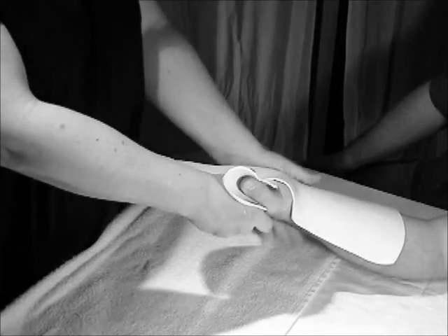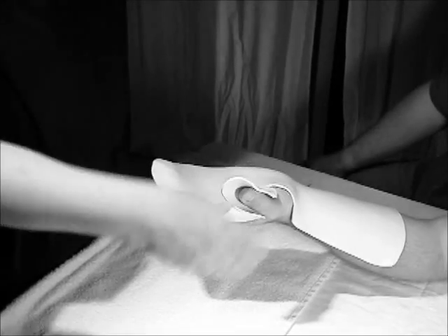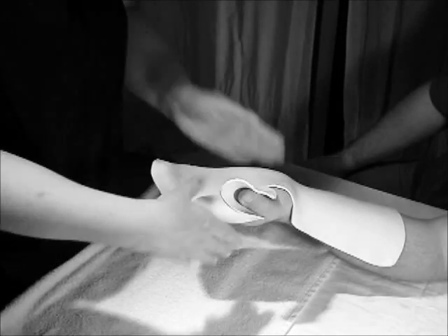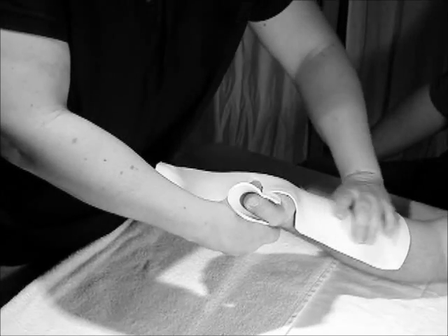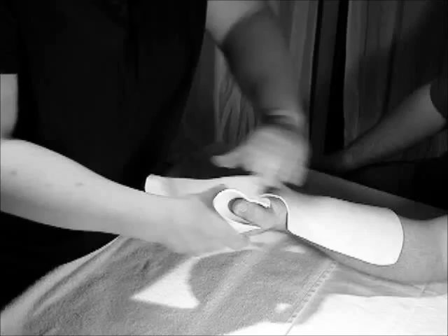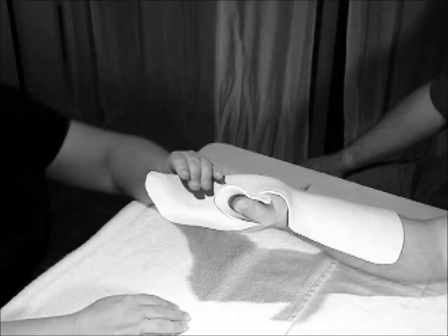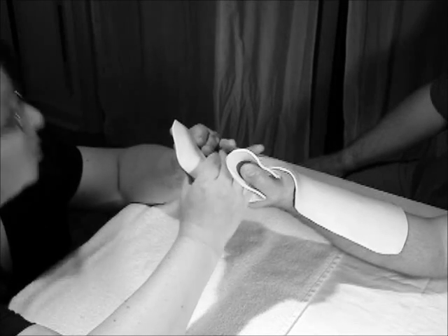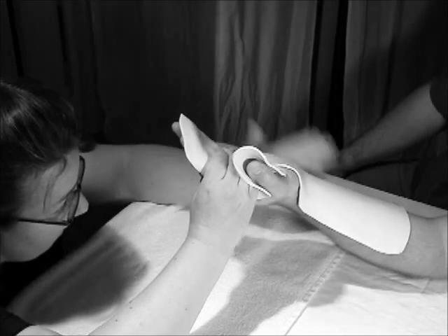And what happens is when you turn the whole arm over, the muscle belly changes in the forearm mass, so it's important that for the last couple of seconds, when you turn it over, we're going to make sure that he's in pronation, so that's really how he's going to wear the splint at night.